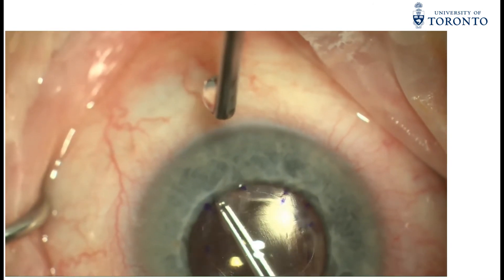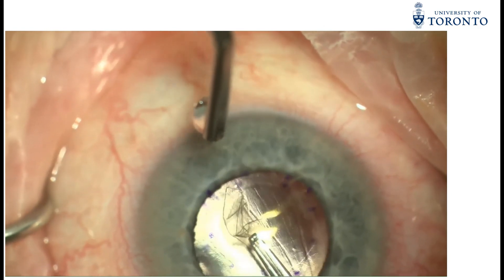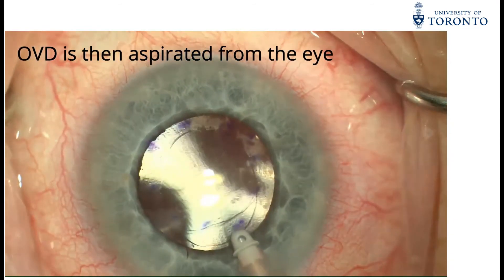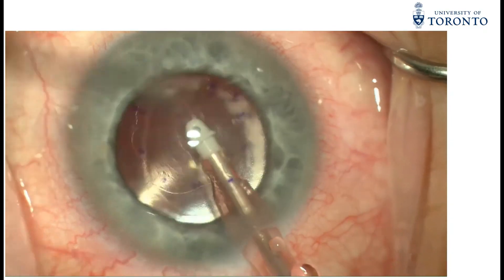Once this is completed, the Descemet's tissue is then removed from the eye via the main wound. Thorough irrigation and aspiration is then performed before hydrating the main wound.